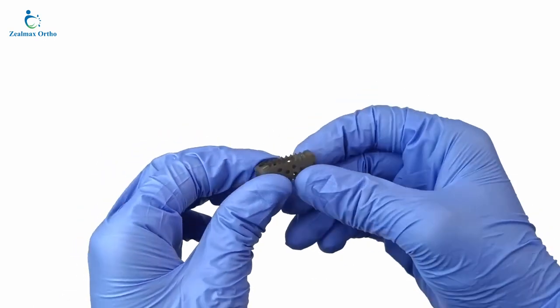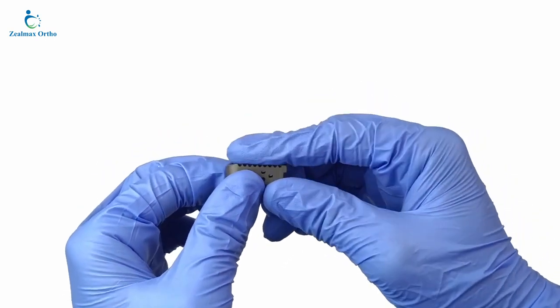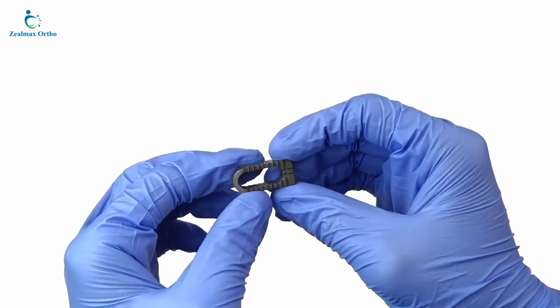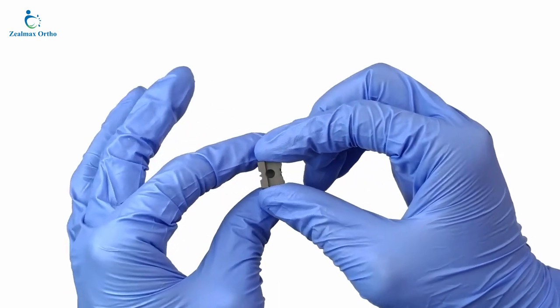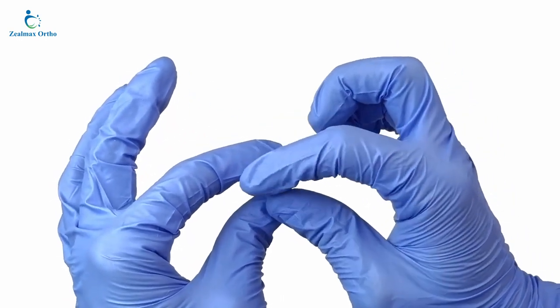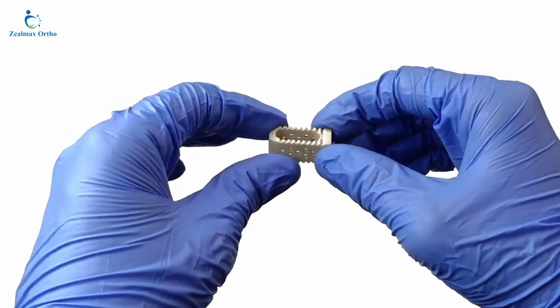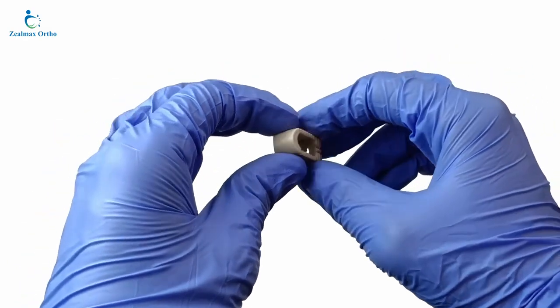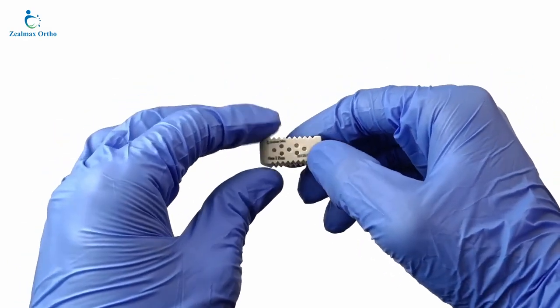PLIF bullet type cages are popular choices for addressing lumbar spine issues. PLIF bullet type cage is constructed from titanium grade 5 and PEEK materials for durability and biocompatibility. It is available in various sizes for surgeon flexibility and patient customization.